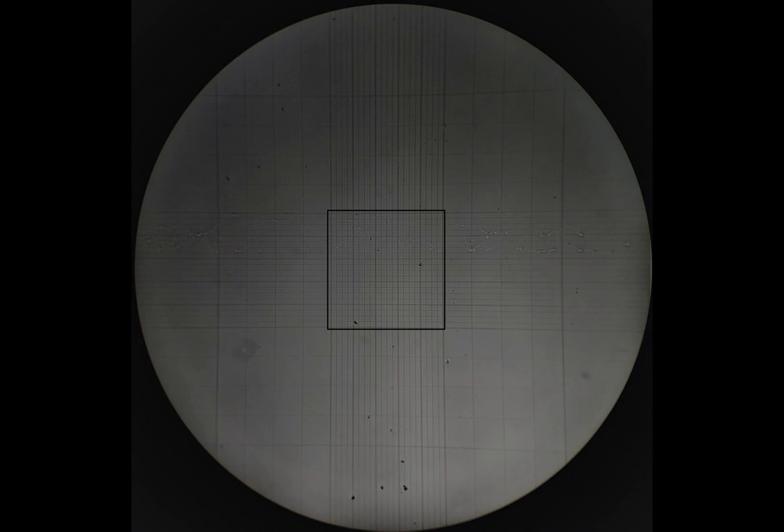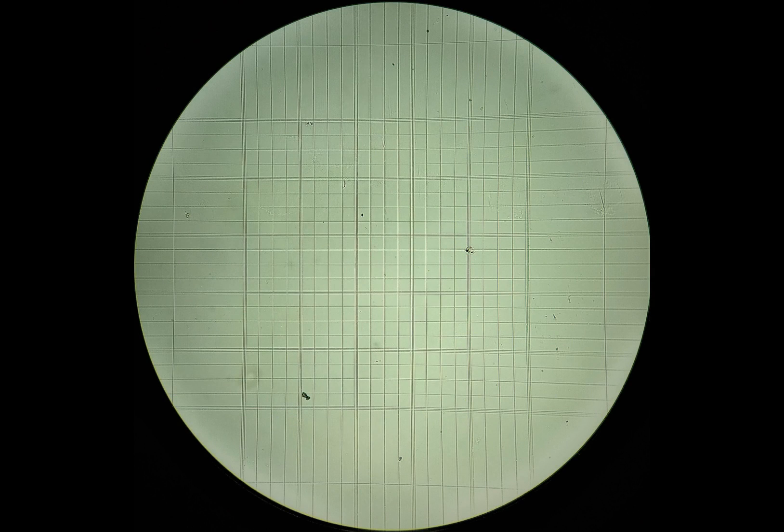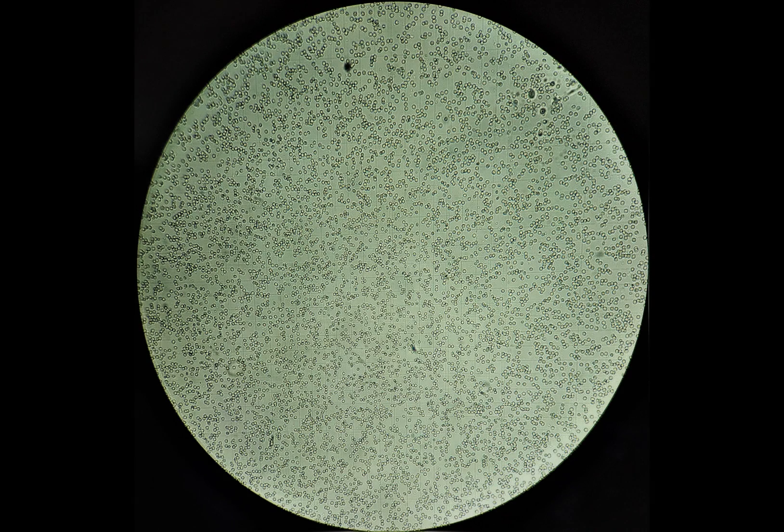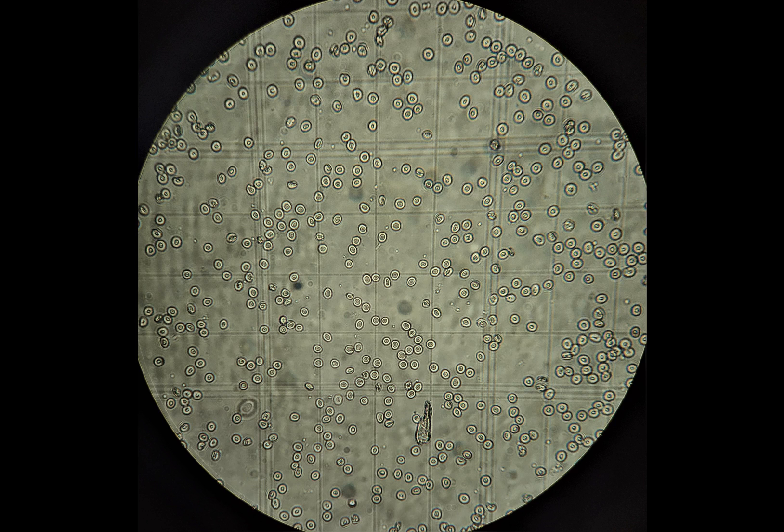Once you've located the RBC counting squares, switch to 10x then to 40x objective to begin the counting. Locate the 1st, 5th, 13th, 21st, and 25th smaller squares in the RBC grid. Applying the margin rule or L rule of cell counting, count the RBCs lying inside these squares and those lying on the borders of the lower and left side of each square. Do not count those cells lying on the borders of the upper and right sides of the squares. This is how RBCs will appear on the counting grids under 10x, and here are RBCs under 40x as seen in one of the 5 smaller squares. Remember the margin rule and count the cells in each square accordingly.